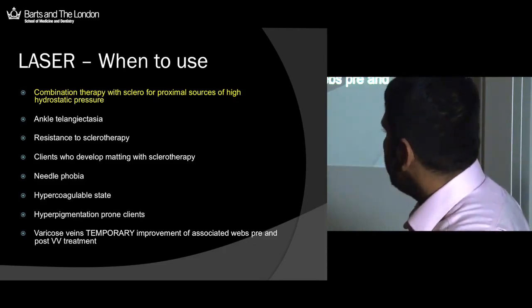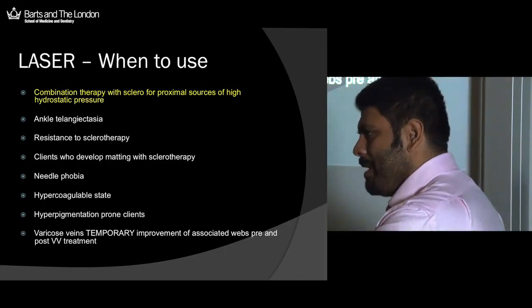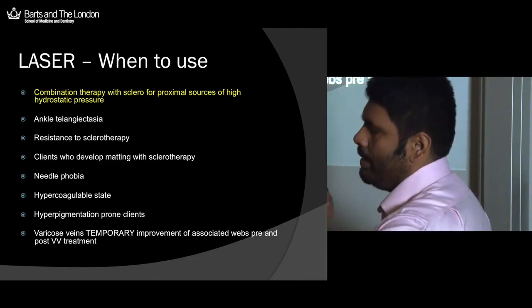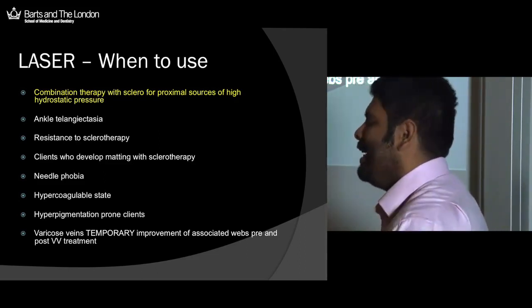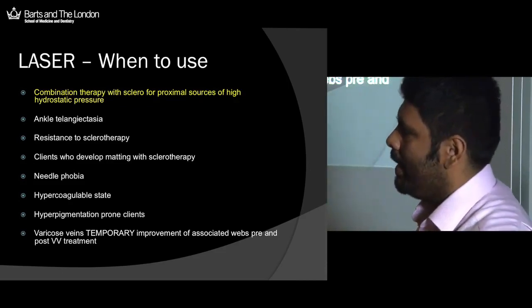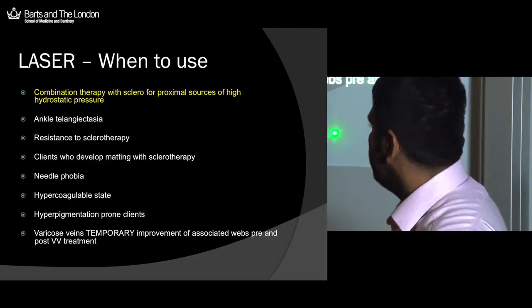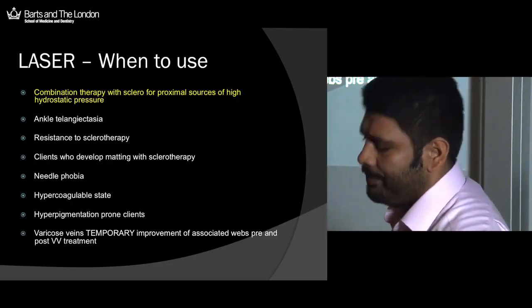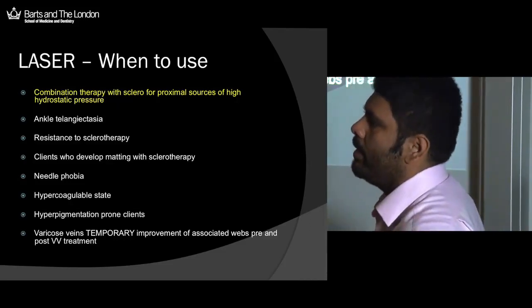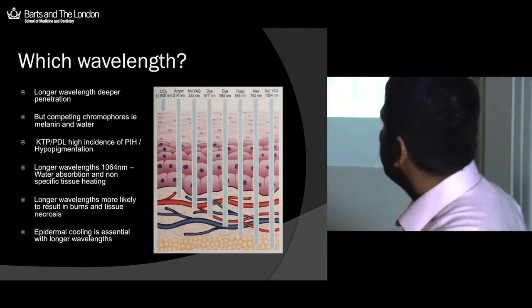And varicose veins, this is, like I said, that scenario where people say, look, doctor, I know I need to get these larger veins treated, but really, can you do something about these purple veins? Well, if I'm going to do it safely, and it's still not a good idea to encourage this mentality, but you could do it pretty safely with a laser in terms of not causing any other larger venous complications. Now, which wavelength to choose?